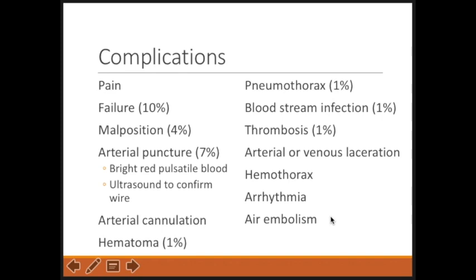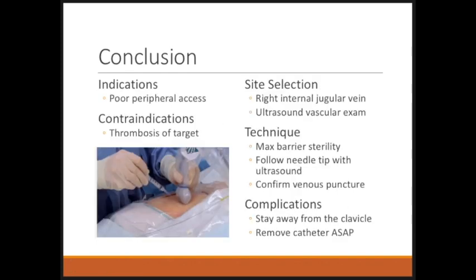And the same thing with removing the catheter: the puncture site should always be below the heart, and the patient should be bearing down and not inhaling while the catheter is being removed. So just to summarize, always consider a central venous catheter, especially in peripheral venous access patients that you're considering a PICC line on the floor if you think it may just be short-term use.